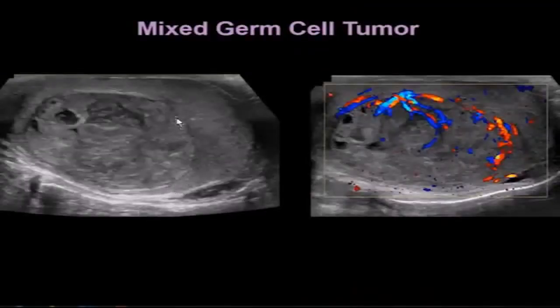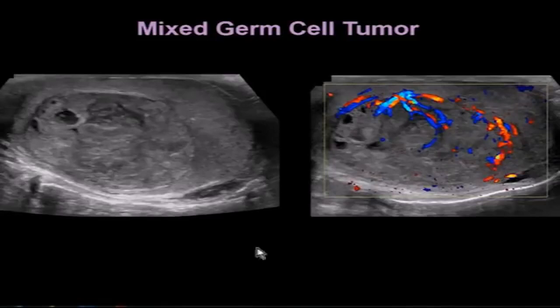This patient has a more heterogeneous mass. It has some cystic areas, some hypoechoic areas, and some brighter areas. It also has a lot of blood flow, and this proved to be a mixed germ cell tumor.